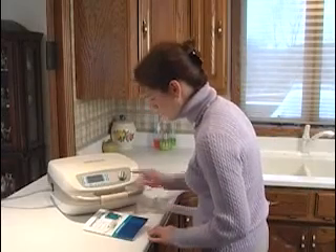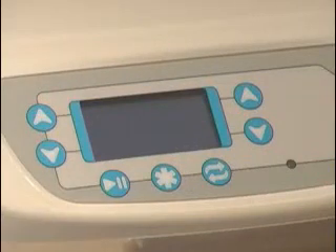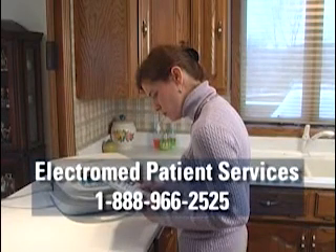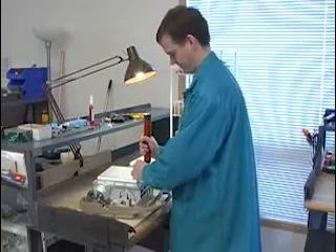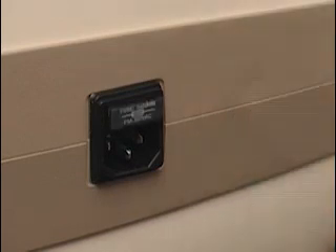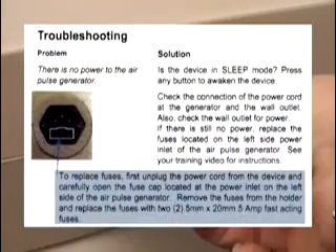If it appears your SmartVest system is not working properly, check to make sure it is not in sleep mode. Press any button on the front panel to see if it will turn on. If it is not in sleep mode, check the troubleshooting section in your instruction manual. If your troubleshooting efforts do not restore the performance of your system, call ElectroMed Patient Services for more assistance. If your unit requires servicing, ElectroMed will provide you with a replacement unit. Attempted repairs by an unauthorized person will void your SmartVest warranty. All repairs must be performed by authorized ElectroMed technicians. The only exception is replacing a blown fuse. To check for a blown fuse, first unplug your generator. The unit's two fuses are located adjacent to the power cord receptacle. Remove the fuses from their holder and replace them according to the procedures outlined in the troubleshooting guide in your instruction manual.